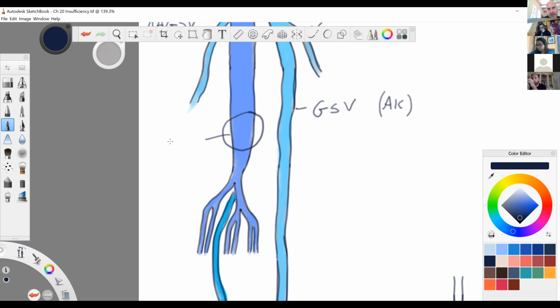So that's going to be the popliteal vein, behind the knee. Of course, this is dropped down, and these veins, we haven't followed them yet, and we probably never will because they never get DVTs. These are the anterior tibial veins. You can put VV if you want. I'm just going to put apostrophe S, ATVs, anterior tibials.